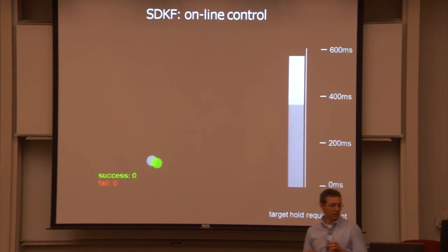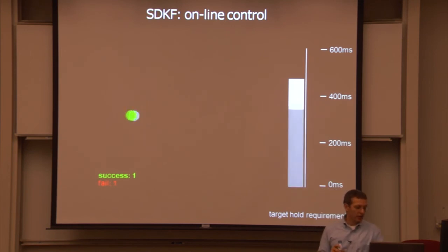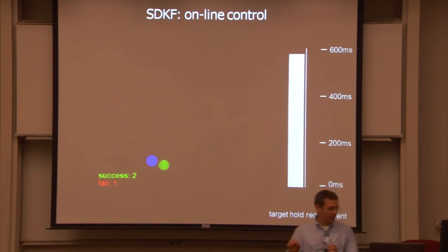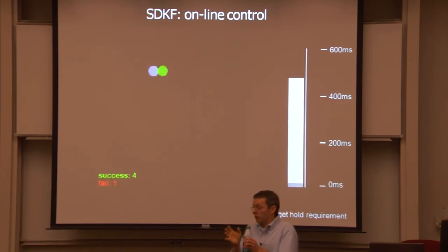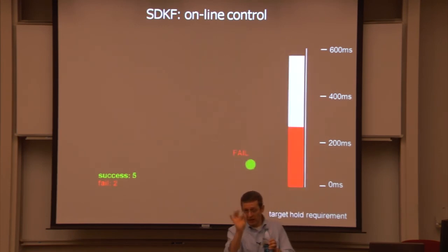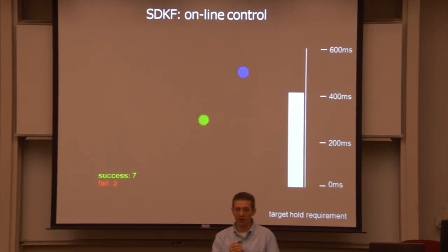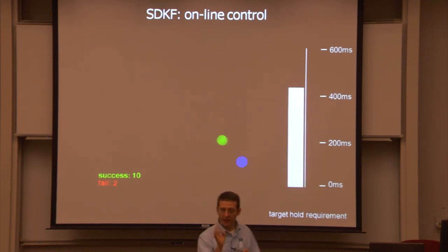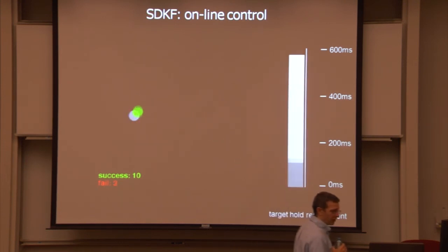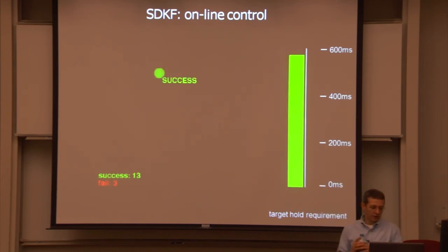So this is what the speed dampening Kalman filter looks like online. So you'll see that the monkey has more ability to hold that on the target. And a lot of times what you'll see is what he's really trying to do under both the Kalman filter and this filter is that when he gets that cursor onto the target, he tries to scribble it around to keep it inside the overlap area, consistent with success. And right now, we're taking those natural corrective movements that he makes, and we're actually using that as a signal that that cursor ought to move slowly. And so in this case, out of the 16 trials that we perform, we get 13 successes.